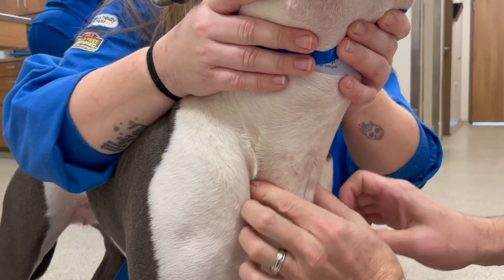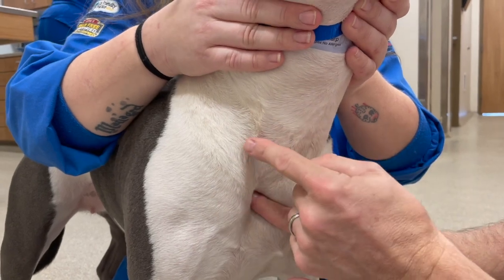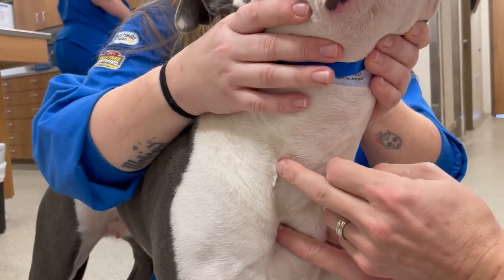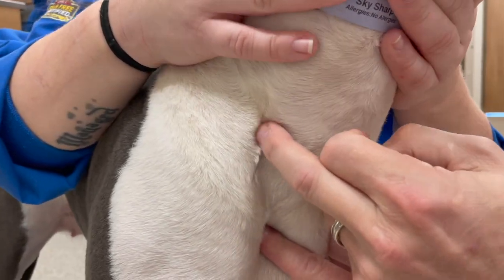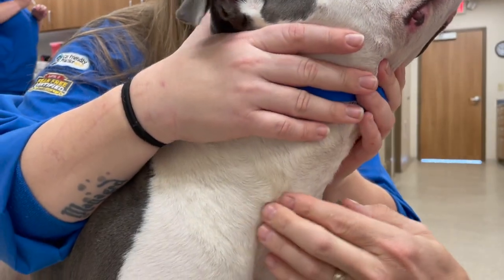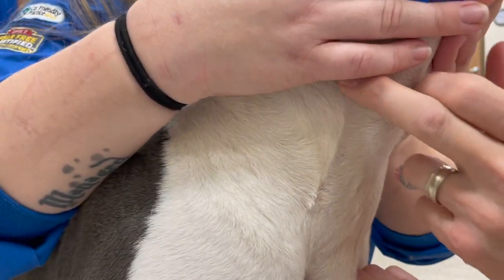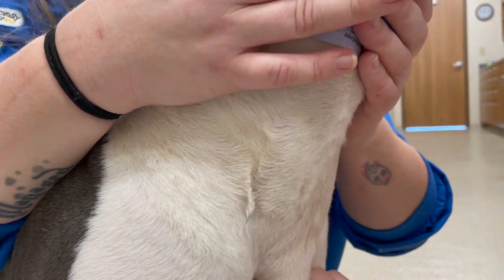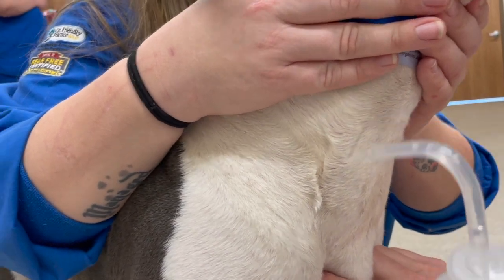Very muscular, but you can feel her trachea — it's always right in the middle — and then I can feel these jugular furrows. You can see where those muscles come together into that groove right there, the jugular furrow. I run my fingers down to the thoracic inlet and hold off that vein. Again, right under this little cowlick there's a vein. I bounce it and feel it and get a feeling of where it is all the way along. I'll wet it down with some alcohol; maybe it'll shine and show up better for you.